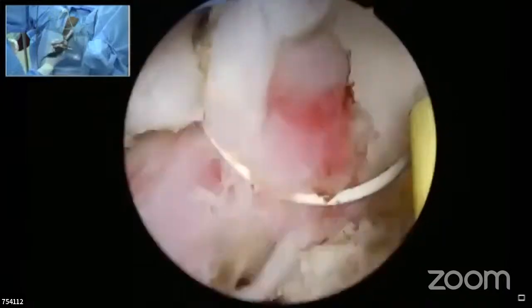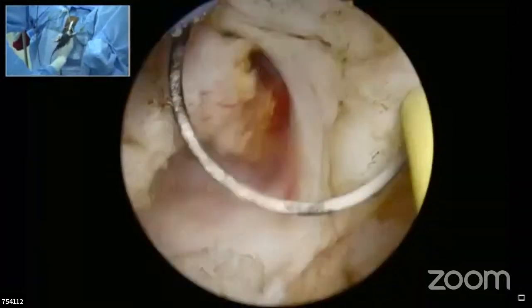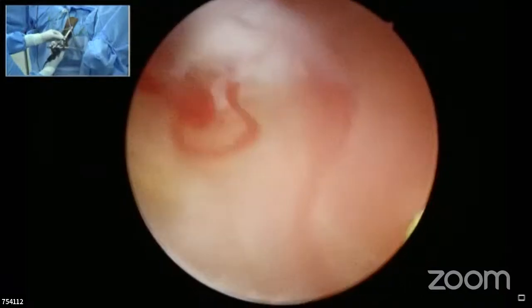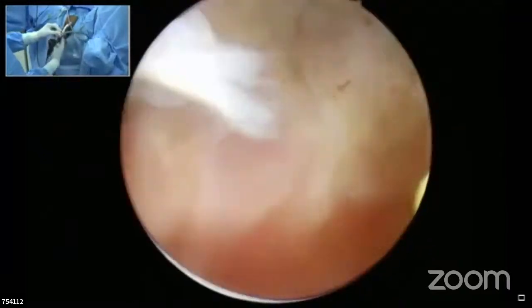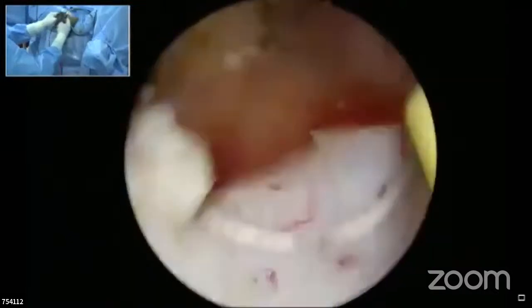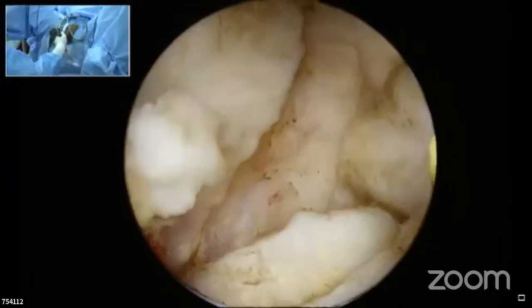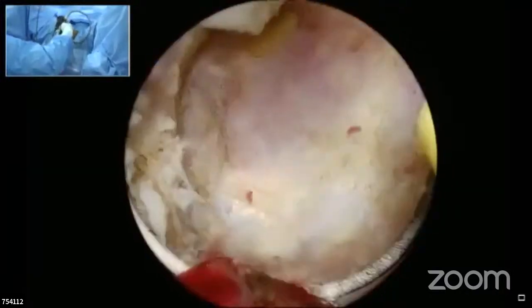But in case such a perforation has a sinus underneath, that really becomes a problem. You may continue. See that, there is no bleeding. So there is no sinus here, so that's not a threat. But if there is a venous sinus underneath, it becomes very difficult to control. As long as you are working with a positive pressure, you won't realize it. Only when you put the inflow off, you suddenly find there's a pool of blood coming through.